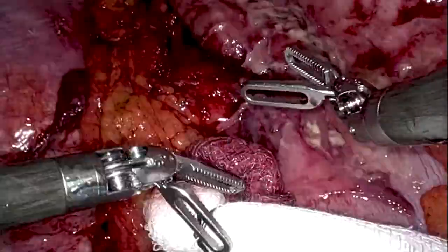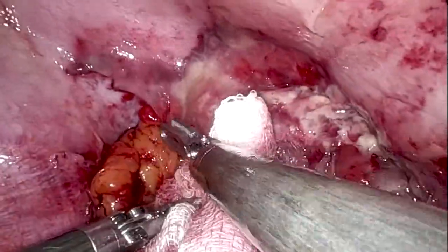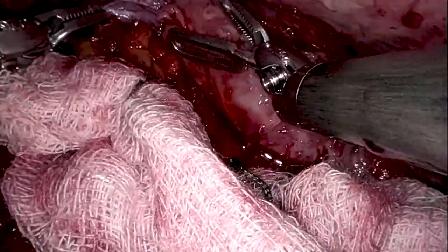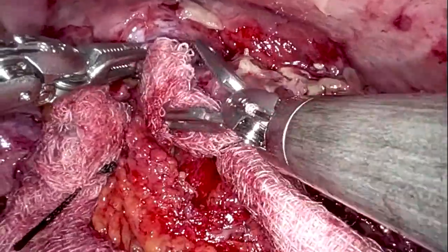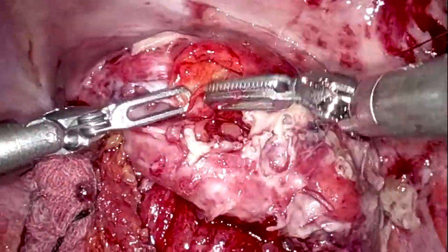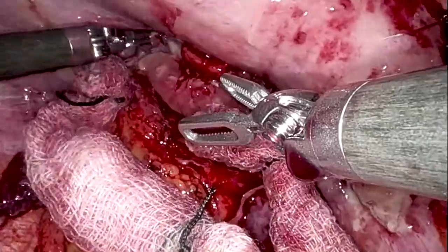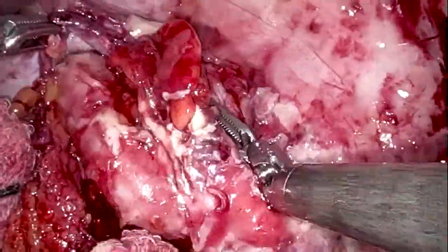The surgeon uses the cadier forceps to find the anterior medial aspects of the wound and clear blood. Because this patient presented 72 hours post-injury, there are gentle adhesions which the cadier forceps can melt through. Waiting two to six weeks would result in much more fibrous adhesions, making this a far more complicated operation unnecessarily. It's also important to identify any bowel that has herniated into the thorax, since the thorax is a negative pressure environment and the abdomen is positive pressure, causing omentum and bowel to pop through. The CT scan showed minimal bowel with healthy, non-incarcerated appearance.